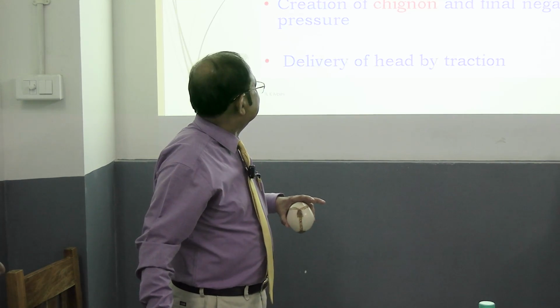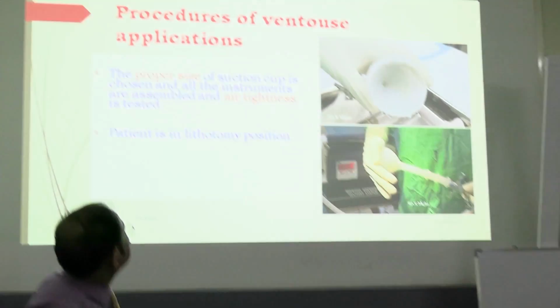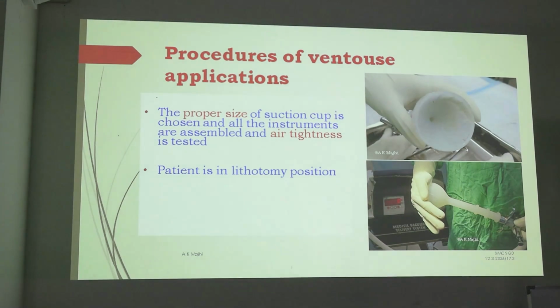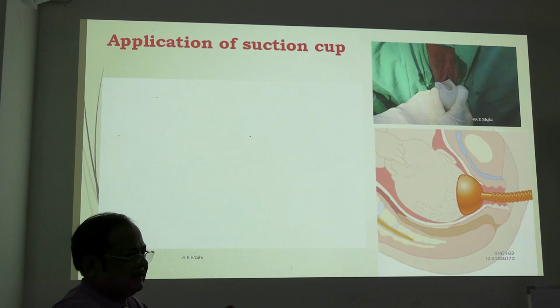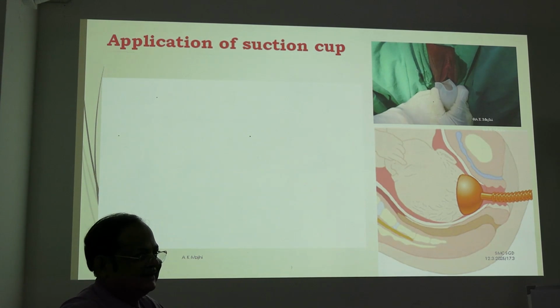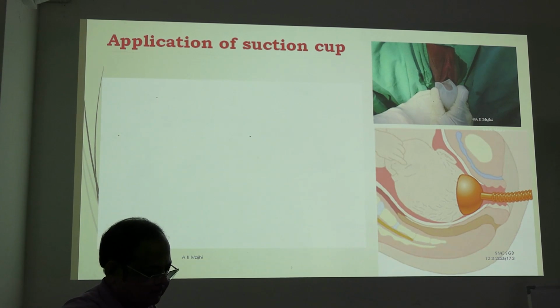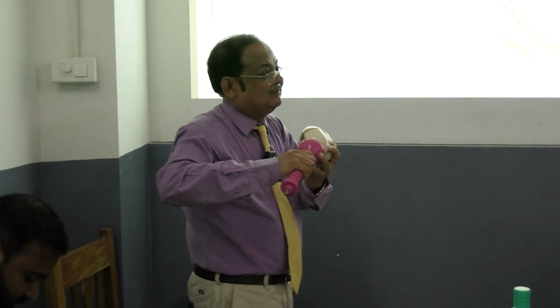তাহলে হেড ইঞ্জুরি হয়ে যাবে। ডেলিভারি অফ দ্য হেড বাই ট্র্যাকশন, ঠিক আছে, এটা সব ভিডিওতে দেখিয়েছি। দ্য প্রপার সাইজ অফ দ্য কাপ ইজ চুজেন। লিথোটমি পজিশন, এপিসোটমি তো লাগিয়ে দেওয়া হলো। এইভাবে লাগাবে, সাইড থেকে লাগাবে, তারপর লাগিয়ে দেখে নেবে যে চারদিকে হয়েছে কিনা। একটা চিকনন তৈরি করবে কম প্রেশার দিয়ে, 140 150 মতো দিয়ে, তারপরে পিভি করে দেখো কোনো ম্যাটার্নাল টিস্যু লেগেছে কিনা, তাহলে ম্যাটার্নাল টিস্যু ইঞ্জুরি হবে। তারপরে তুমি ফুল প্রেশারটা তোলো। ক্লিয়ার তো?